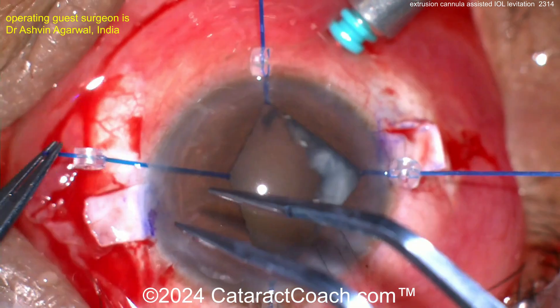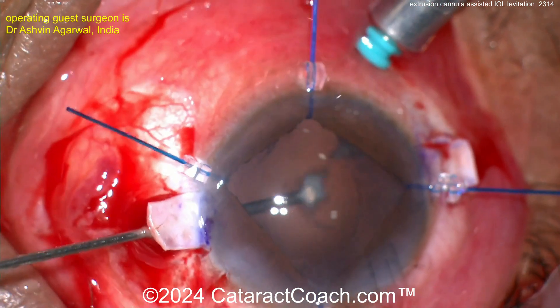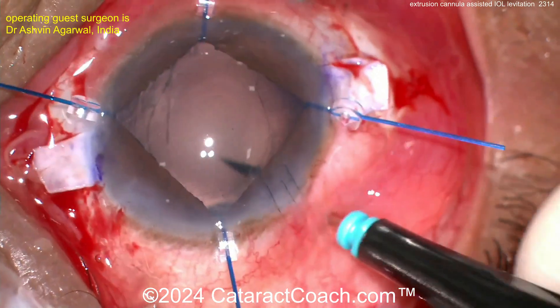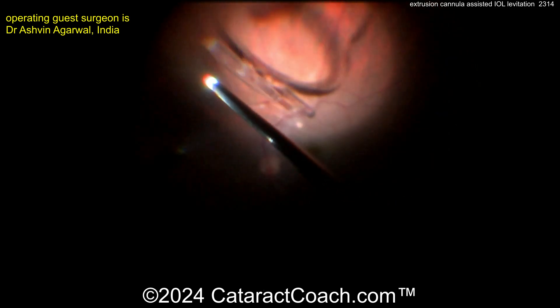Iris hooks going in — good idea to give yourself some visualization. Look at the extra lens material you didn't notice before. Go in from the other side and get all that lens material out — do not leave it in the eye. You can see there's a little bit of capsule, but certainly not enough support for a sulcus lens here.